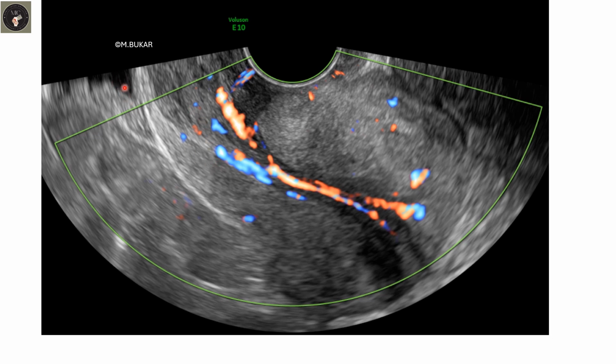Now this is the still image. Remember, this is bladder, retroverted uterus. So this is the posterior wall, this is the anterior wall. So now look at the origin of this vessel. It's arising from the posterior wall. So the pedicle here is arising from the posterior wall, and you can see the feeder vessel down to where the prolapse lesion is.